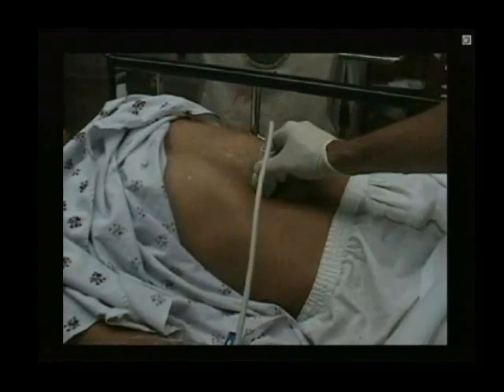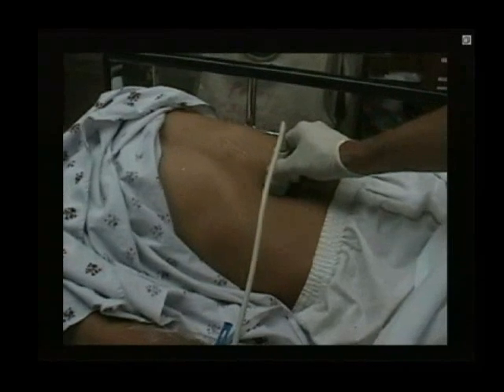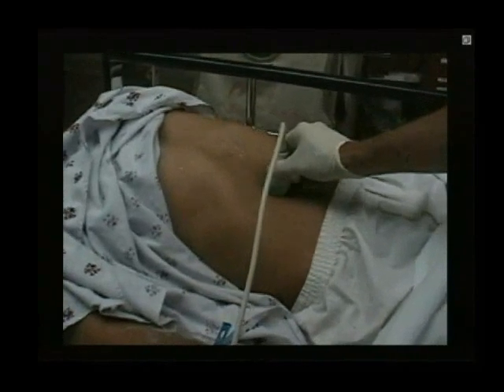And then we can also scan the same patient longitudinally. The marker is now toward the head. You really need to take your time, and if you have a lot of gas, just put the probe in one spot only with a reasonable amount of pressure and hold it. Just hold it and hold it, and then the gas will move out of the way almost all the time. So just take your time. You'll usually get a good exam.